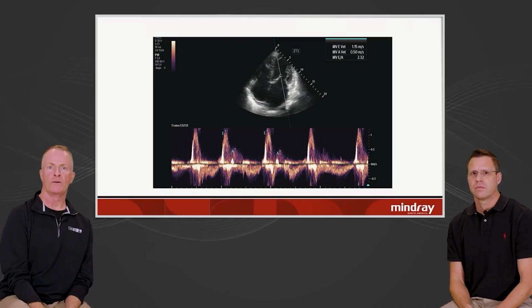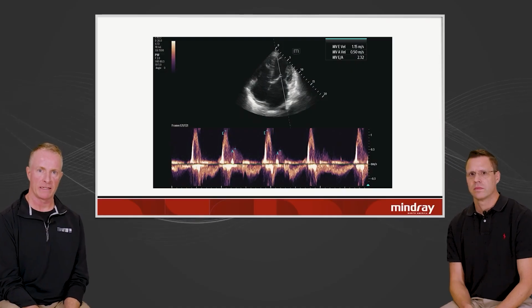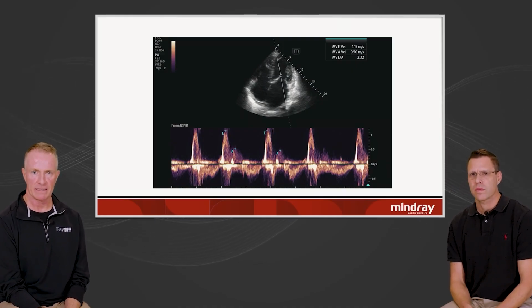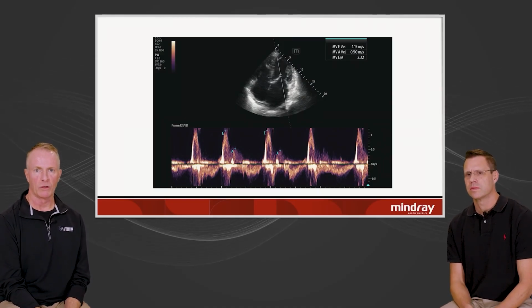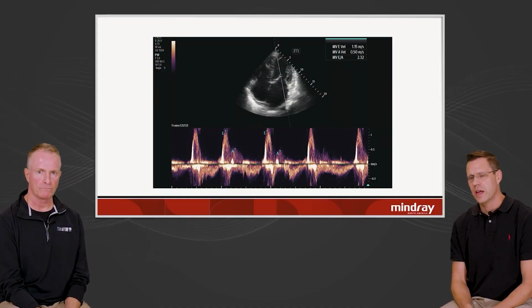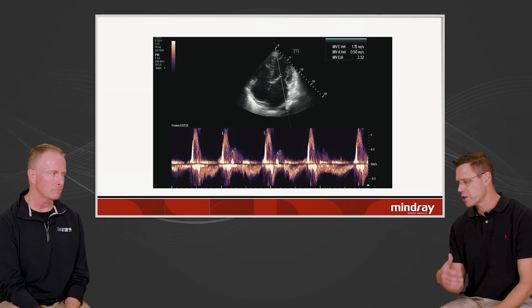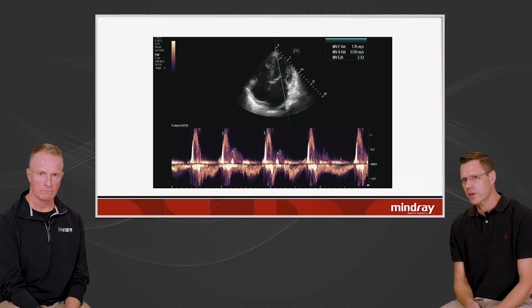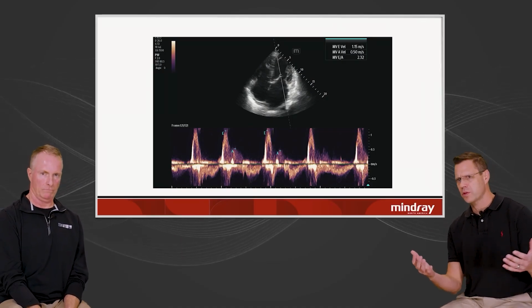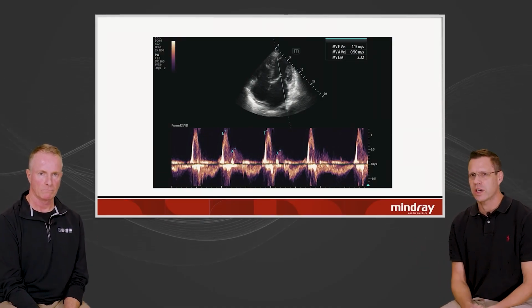Yeah, like this. So when you get worse diastolic dysfunction, the E is towering over the A, more than 2 times the size of the A, and that's more severe diastolic dysfunction. You can see this left atria is huge, which would correlate with that. And then on the screen, you're seeing that E to A ratio get more than 2. And so by understanding just some very fundamental things, understanding that your normal E to A ratio is 0.8 up to 2, and then even though you're like, hey, my E is bigger than my A, it should be normal function, but when you see that E to A ratio get up to 2 or more, you can know that that is advanced diastolic dysfunction.